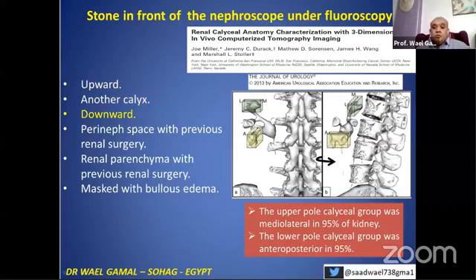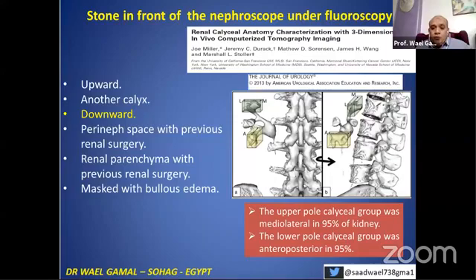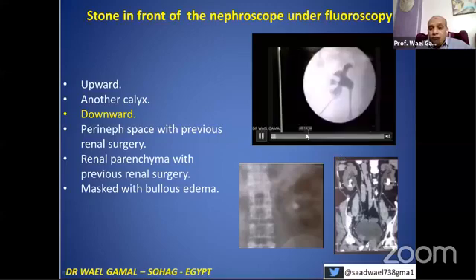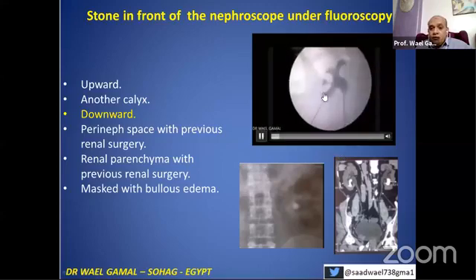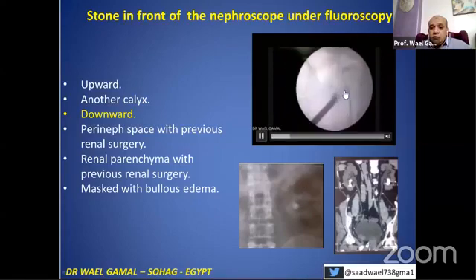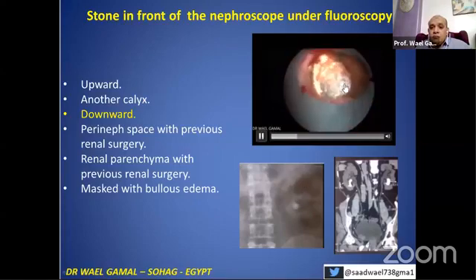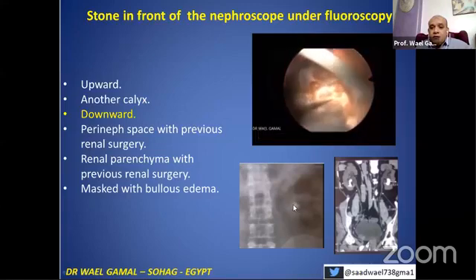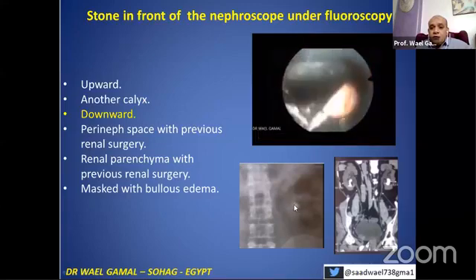It is very important to know the anatomy. The anatomy of the lower calyx and the upper calyx differ: the upper calyx is mediolateral, but the lower calyx is anteroposterior. So there is a stone in the lower calyx. We did this access. Unfortunately, the radiologist told me it is a single stone. We dilate, enter inside, and disintegrate the stone as it appeared to be a single stone. The stone is disintegrated and extracted, and we are about to finish.